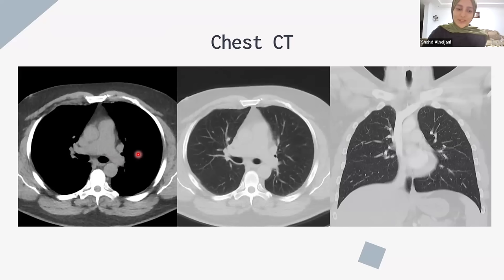We got lung, we got mediastinal, chest, lung again, bone. Okay, so whoever said lung here, if there is any abnormality in the lung, if there is dilation in the bronchioles, for example, can you see them? Can you tell them?